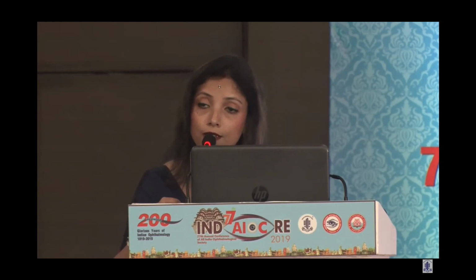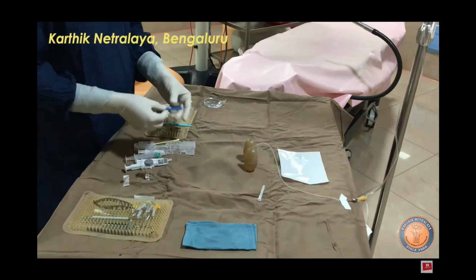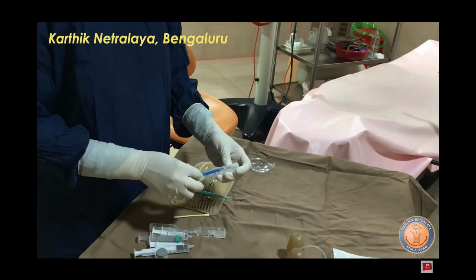There should be a separate dedicated cleaning staff who will be looking only after the cleaning department and not those staff who are assisting us in the OT. The blunt and sharp instruments should be separated. The first cleaning occurs on the table itself.